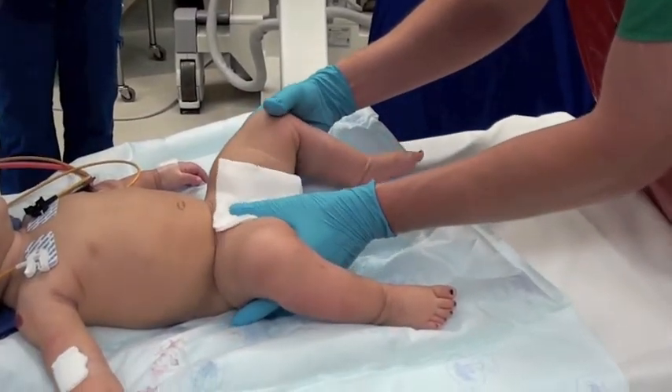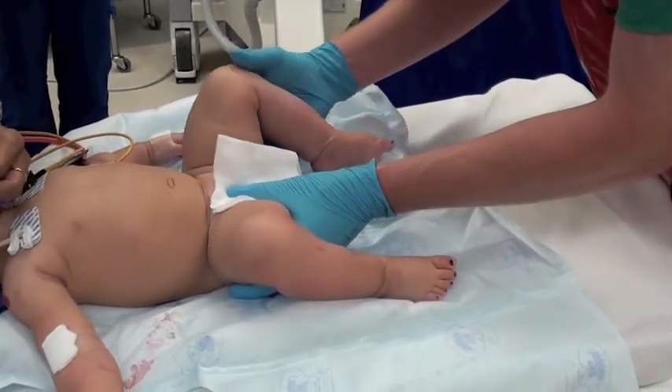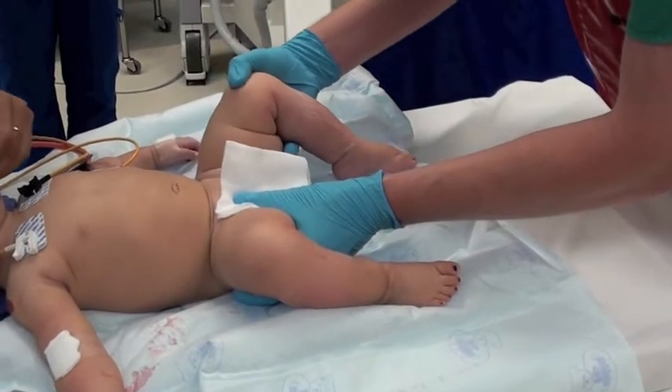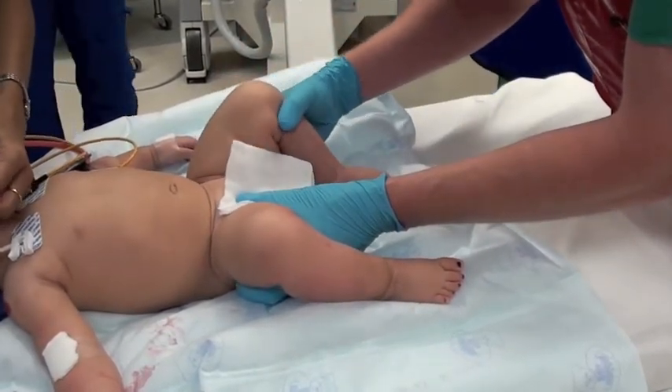This is an examination of a baby under anesthesia showing the hip reduction. Here the hip is being spread and pulled into place. It's actually very gentle and is not painful even when the child's awake.